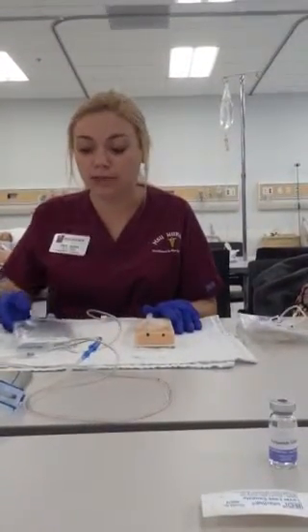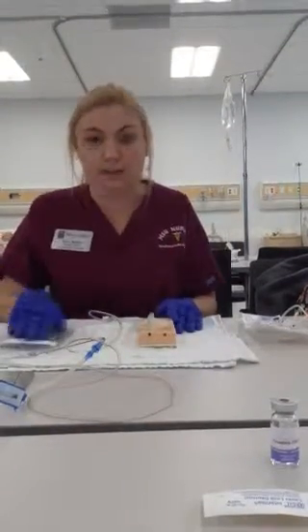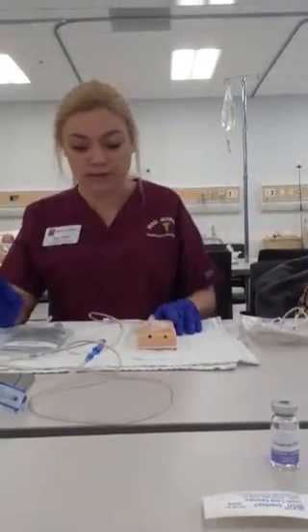Okay, so now we're going to be administering some IV piggyback medication. We're going to administer 500 milligrams or 100 milliliters of levofloxacin, which is an antibiotic that you give at the same time every day.